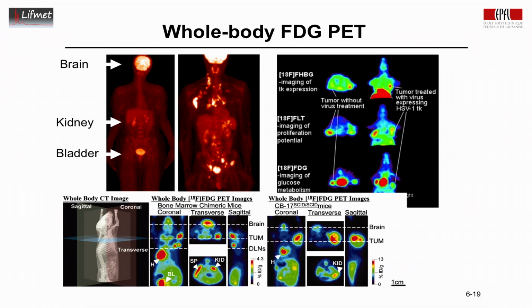And one has to consider that the generation of genetic animal models is relatively costly, so the ability to take an animal subjected to biomedical imaging repetitively and thereby obtain good measures of the evolution of the disease, or whatever we are looking at, allows us to reduce the number of animals that need to be produced and also reduce the number of animals used for animal research. So this concludes the examples for positron emission tomography.